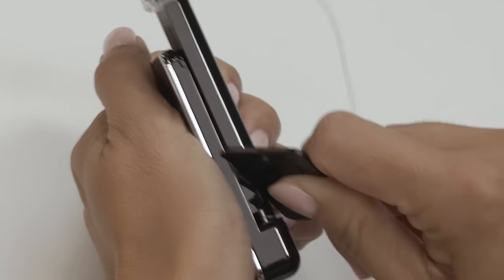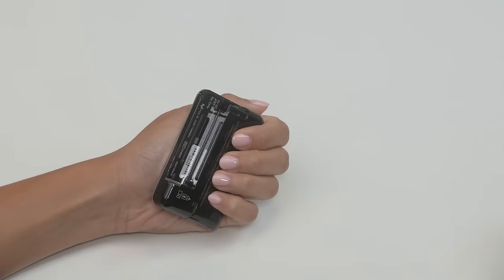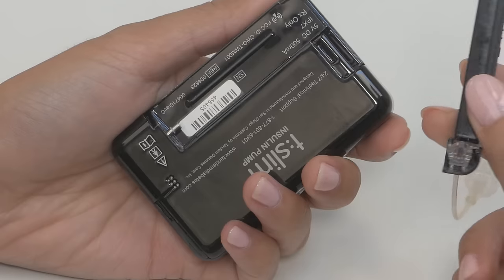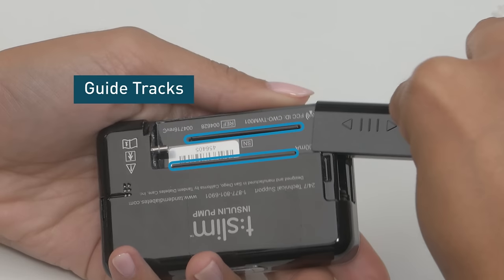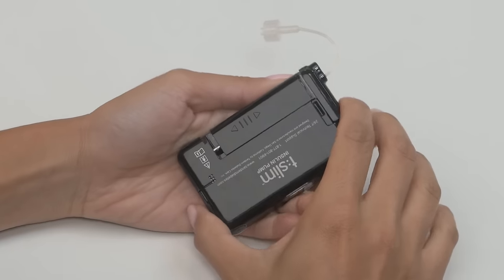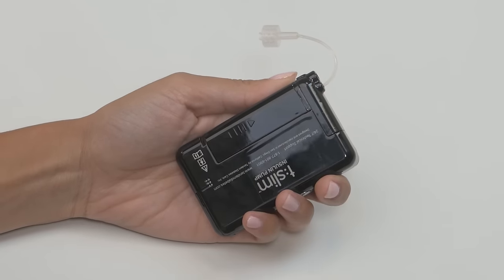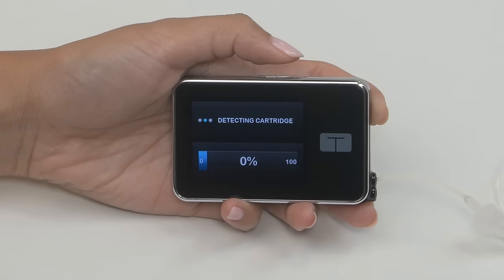Remove your used cartridge using the removal tool. You can also use a coin. Install your newly filled cartridge by placing the bottom edge at the end of the pump like this and lining up the grooves on either side of the cartridge with these guide tracks on the pump. Once lined up properly, push the cartridge on until you feel it click into place. The cartridge should fit smoothly against the pump. Your pump will take a few moments to detect the newly installed cartridge.